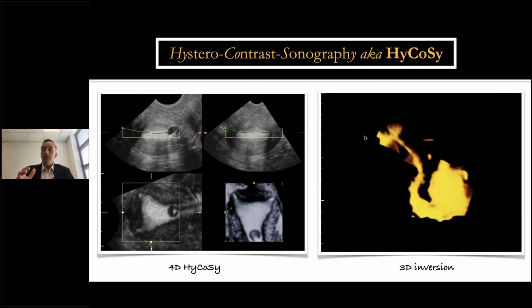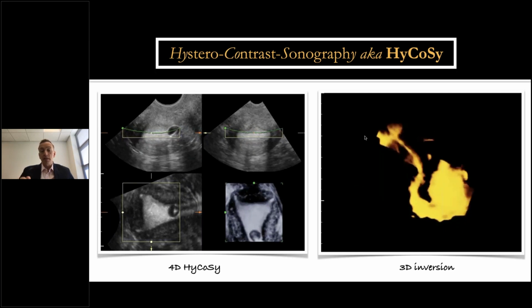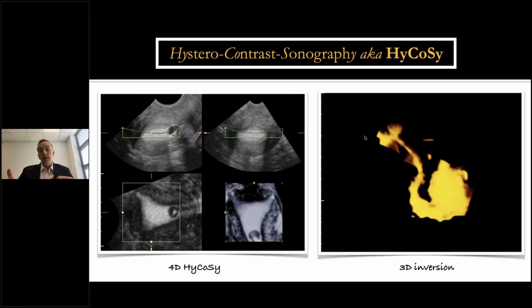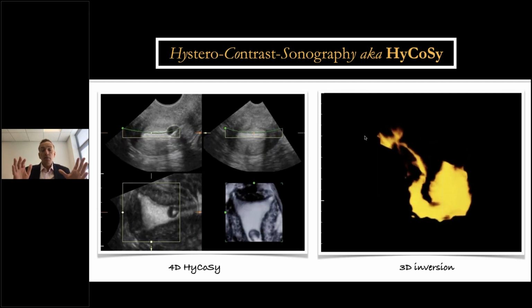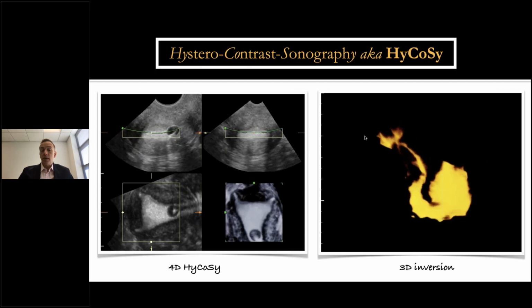It's a very easy procedure, but you've got to be very good at scanning because it's all about very subtle movements of the ultrasound probe, very tiny micromillimeter movements to the left, to the right, so that you can track that fallopian tube, which we know has a convoluted flow to it. So you're unlikely just to see it in one plane. So I think even though the procedure itself is straightforward, the scanning level that you need to be able to confidently follow the dye so that you can confidently say the tube is patent or not, it is quite tricky actually in some cases.